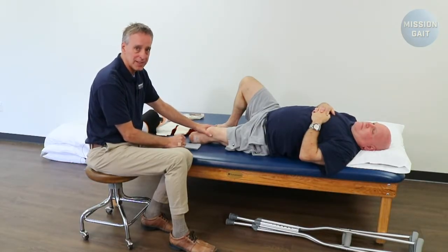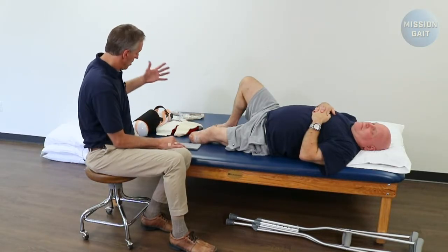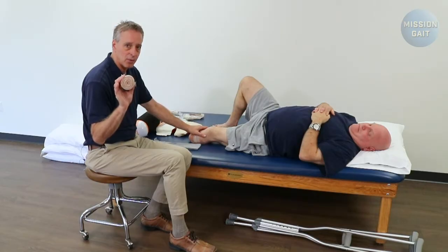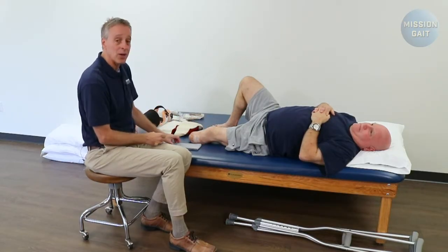Much more commonplace today is people using soft compression. Soft compression can come in multiple different ways. One traditional method is an ace wrap. For a below-knee amputee, a double-length four-inch ace wrap is perfect. Much more common today, though, is the shrinker.